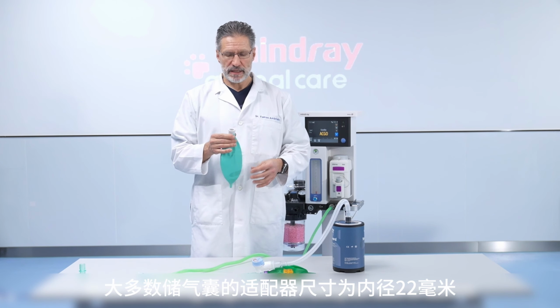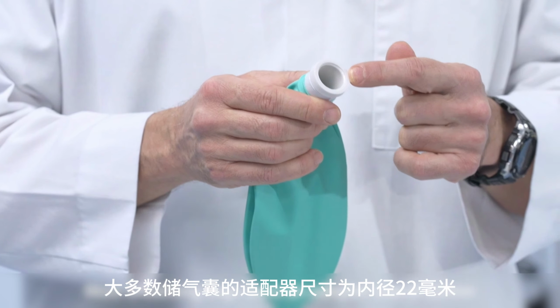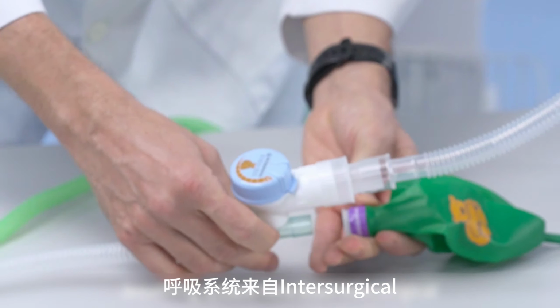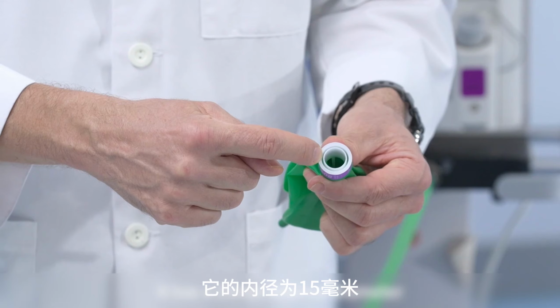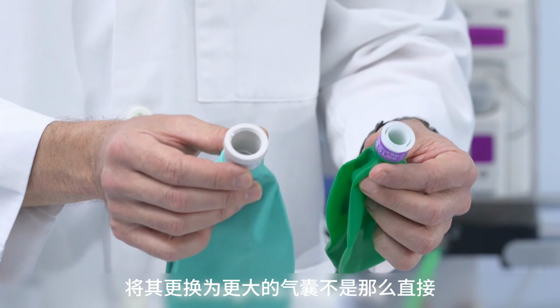Most breathing bags have an adapter size of 22 millimeter internal diameter. However, this particular breathing system here from Intersurgical, the pediatric Mapleson D system, has a different standard. It has a 15 millimeter internal diameter. So it's not so straightforward to change it to a bigger bag.